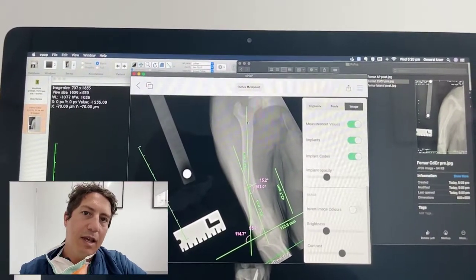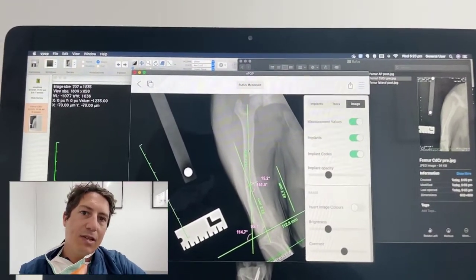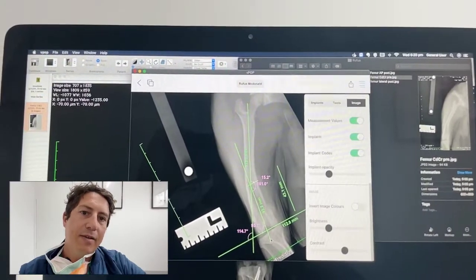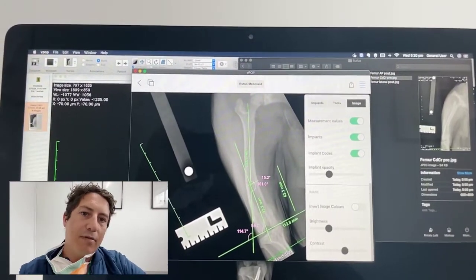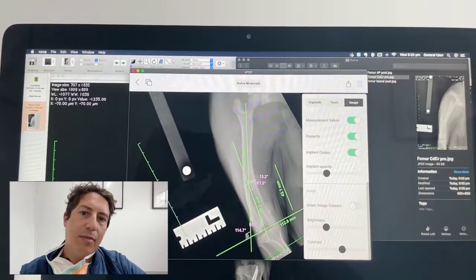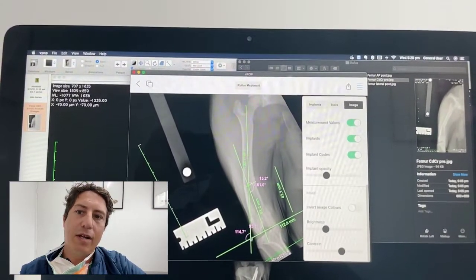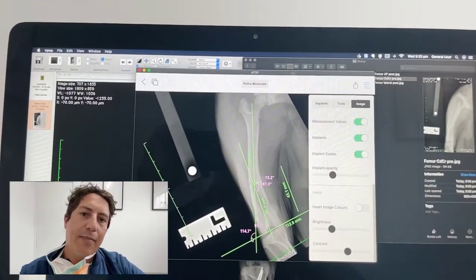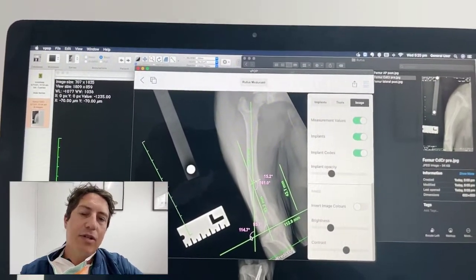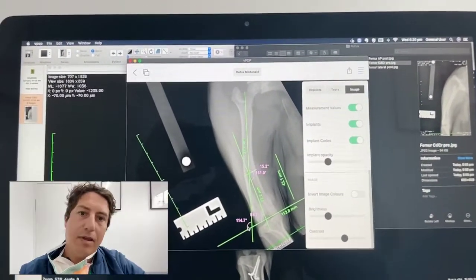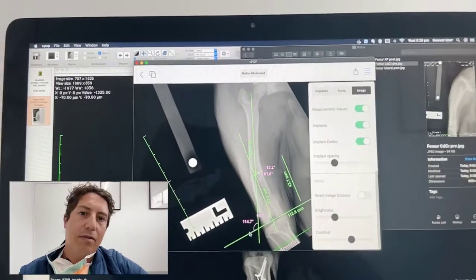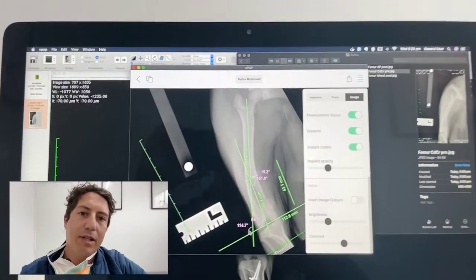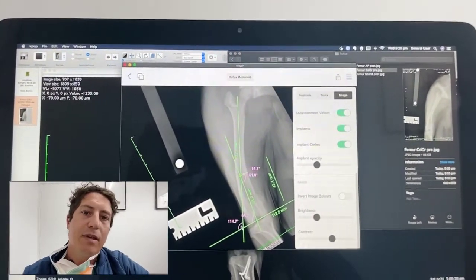What I've done here is looked at the anatomic axis, which is represented by this line here. I put a joint reference line down here, and we can see that this number — 114 degrees — is the lateral anatomic femoral varus angle.